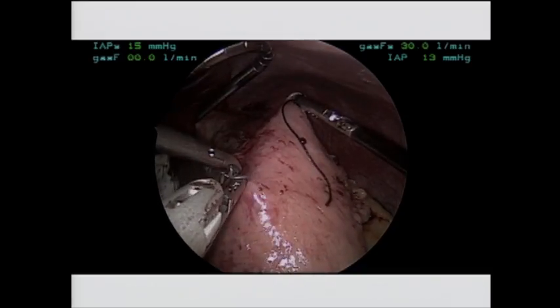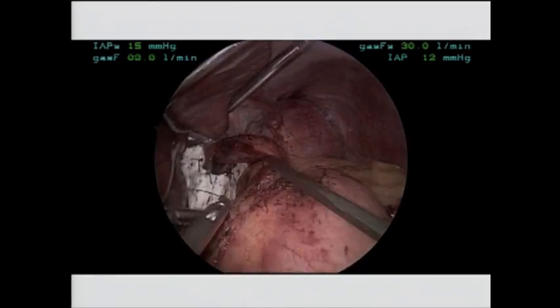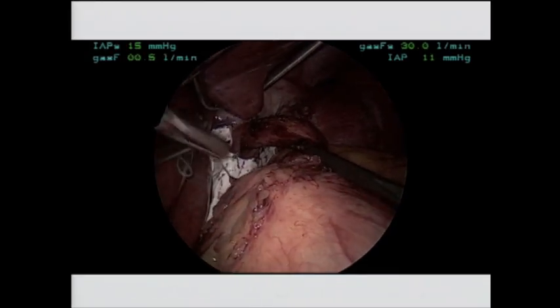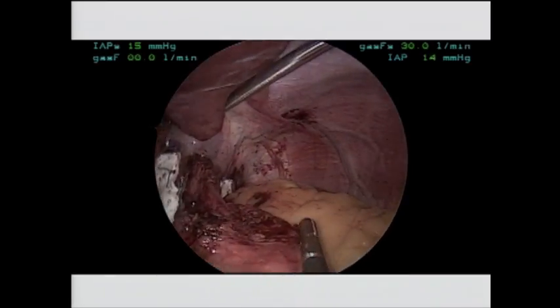So now once the suture's in and cut short, that's the two traction points that we believe will make a symmetrical, proper fundoplication. So you grab that posterior suture and pull it up toward the patient's right shoulder, not downward. Most people want to pull down on it. And as soon as you see the knot, grab hold of the stomach, because you don't want to keep pulling on that suture. If you pull hard enough, they will come out.